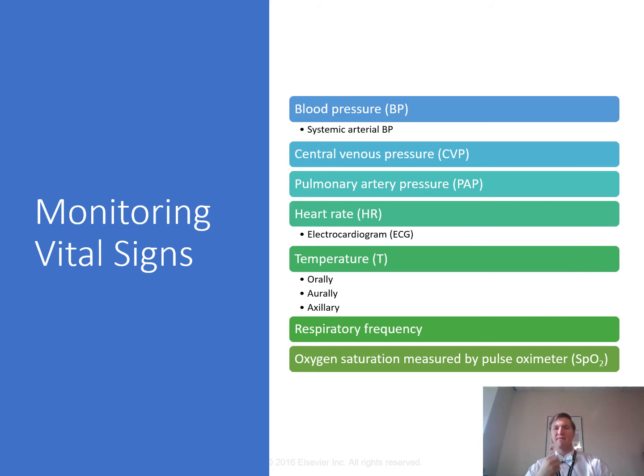In other words, usually when you breathe without artificial airways, you're using negative pressure to pull in. So the thoracic cage is actually negative. It actually sucks blood into the vena cava and pulls blood into the right atrium. But your CVP in theory would go down. But with positive pressure breaths, you're squeezing the vena cava, which would cause the central venous pressures to artificially be high because we're squeezing, right? Smaller container, increased pressure, right? So that's going to cause that pressure to be higher.